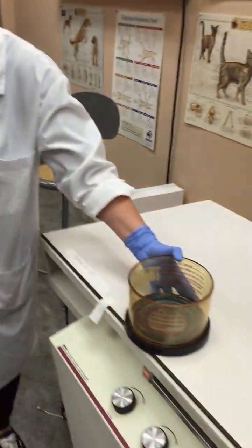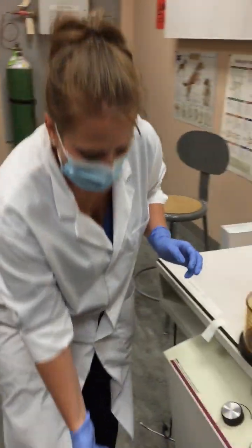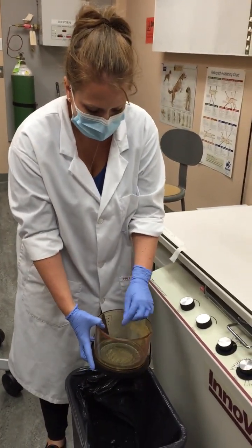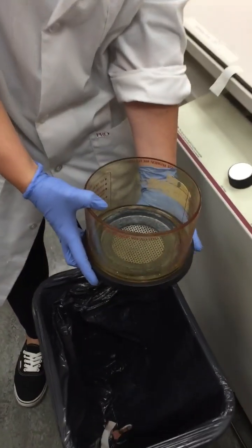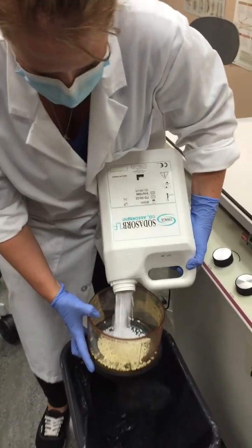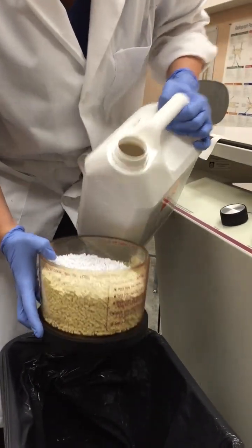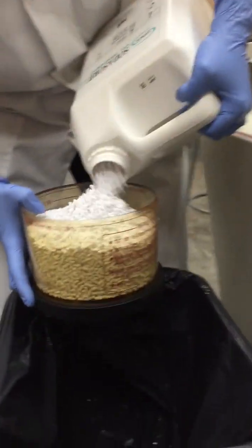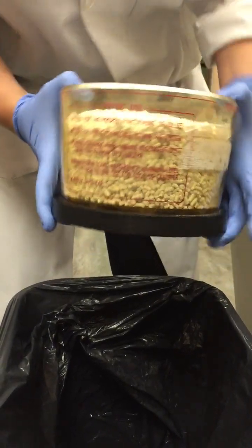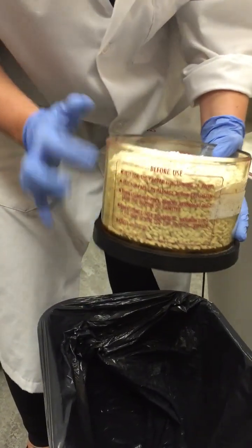Okay, so now what I will do is get my garbage can, take my CO2 canister, and hold it over the garbage can so any dust that comes from the granules will fall into the garbage can. Fill it. And note that you want to fill it almost to the top. Okay, so almost to the top of that line there. So you have a little bit of space at the top there.